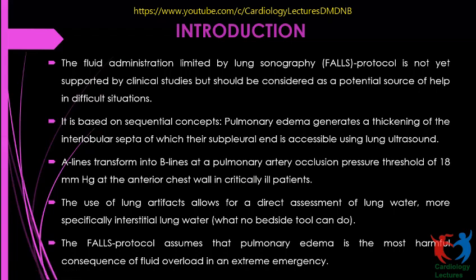So whenever you are giving fluid challenges or fluid therapy to the patients, the fluid starts accumulating in the lung if the heart doesn't take the load. So the A lines will change into B lines. The use of lung artifacts allows a direct assessment of lung water, more specifically interstitial lung water, which no other bedside tool can do. The FALLS protocol assumes that pulmonary edema is the most harmful consequence of fluid overload in extreme emergency. Already patients are sick, and if you are overloading them with fluid, then it gives you a worse scenario.